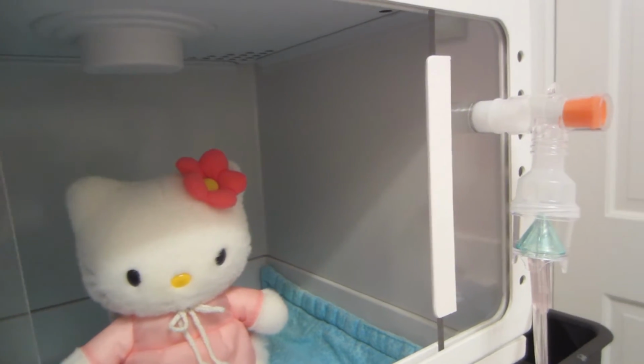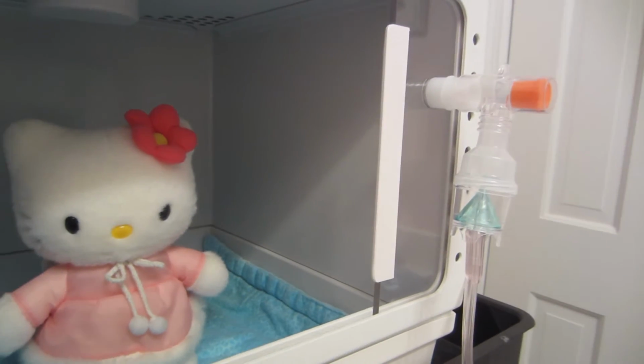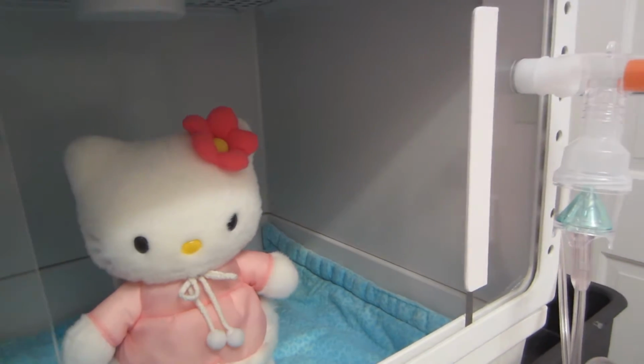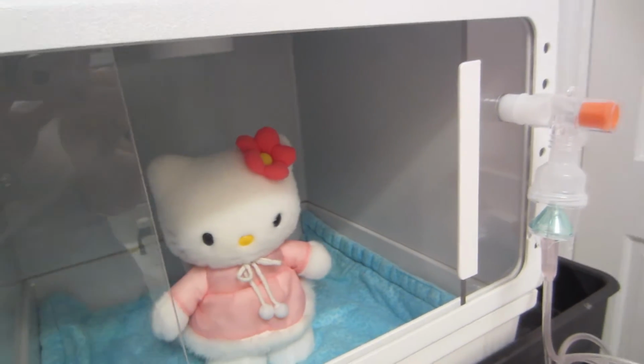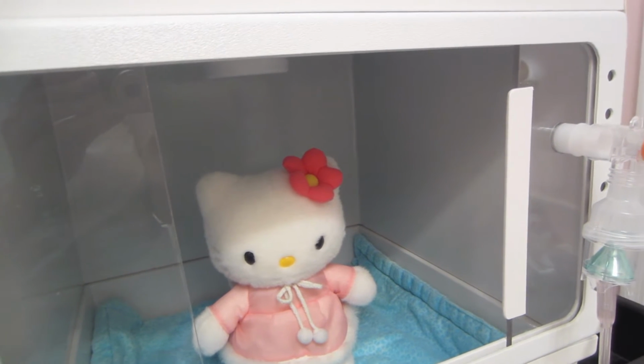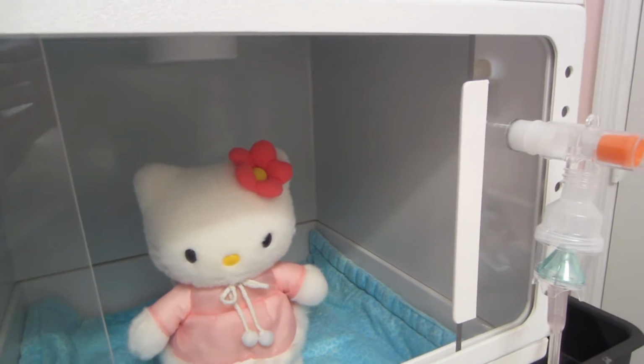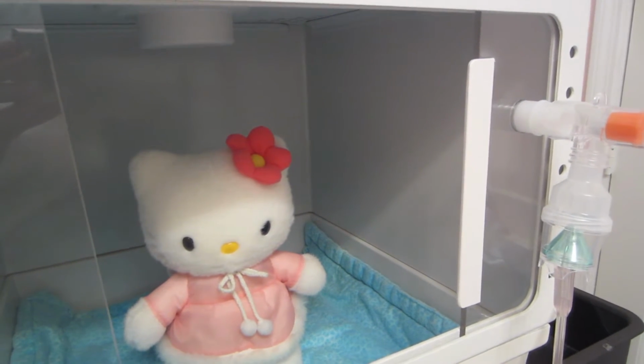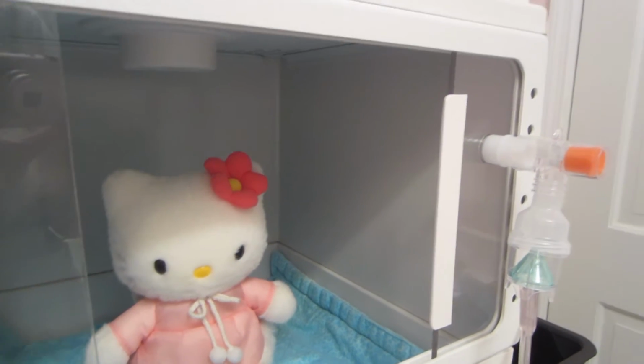This is going to be a real quick video on how to use a nebulizer for cats. And I am using as my nebulizer chamber an incubator, and you don't need to use anything this fancy. You can use a carrier and wrap towels around it, or a plastic bag, something like that.